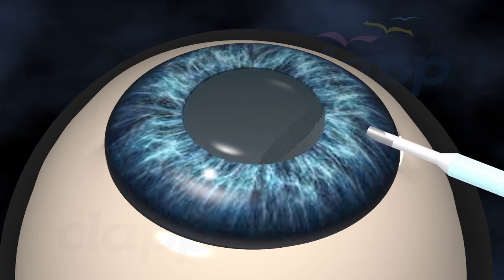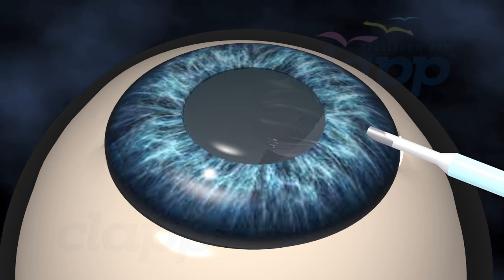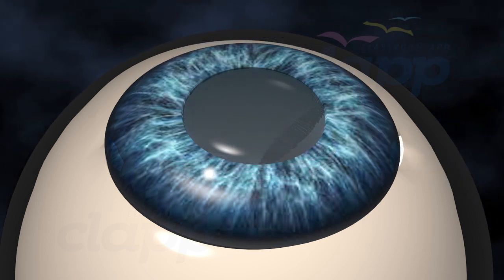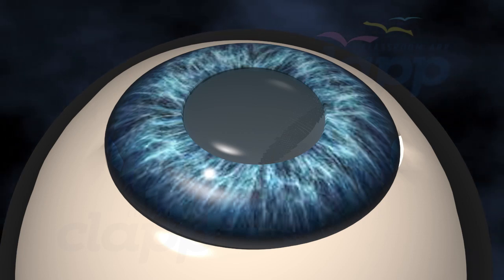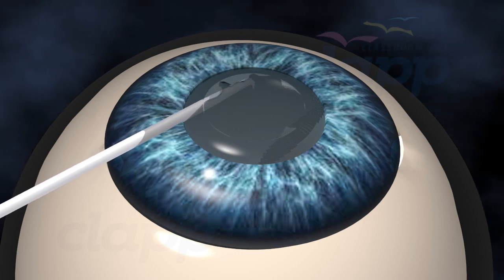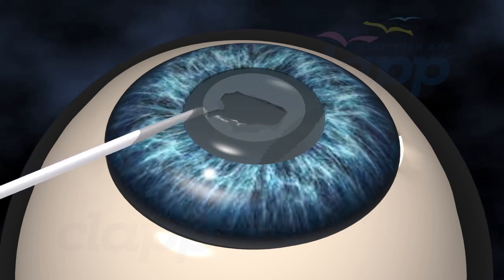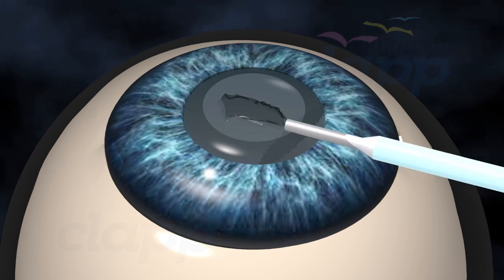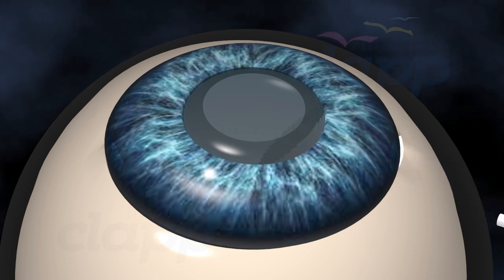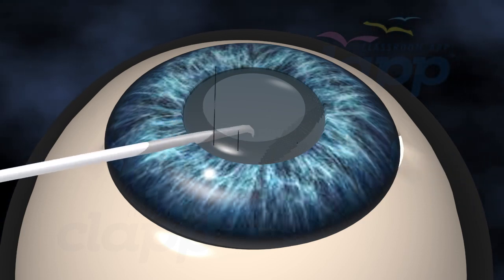Next, the surgeon applies a jelly-like transparent substance called OVD inside the anterior chamber. This will protect the interior structures of the eye at the time of surgery. Then, a round opening around 5 mm will be made in the capsular bag where the lens is located. This will help to remove the cataract lens without removing the capsular bag. Then, the surgeon will break up the cloudy lens and carefully remove it.